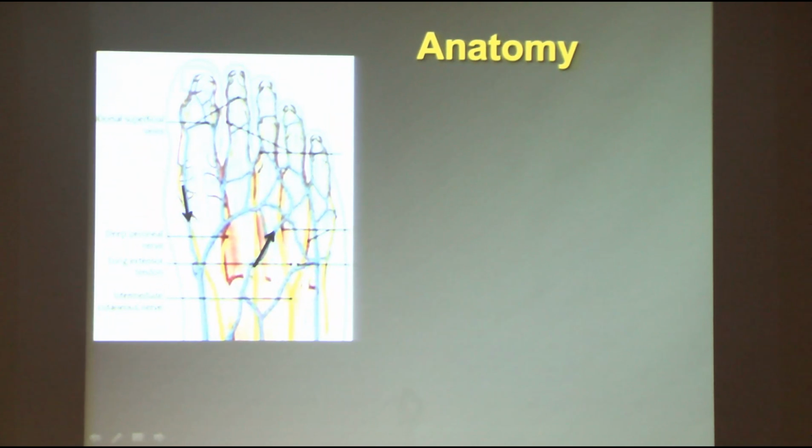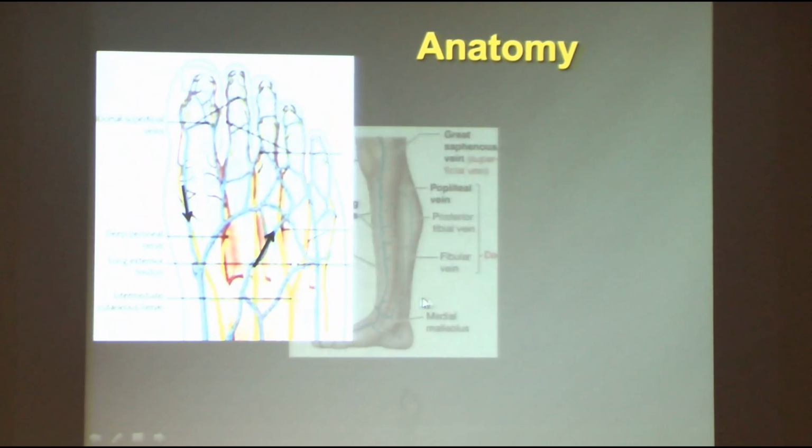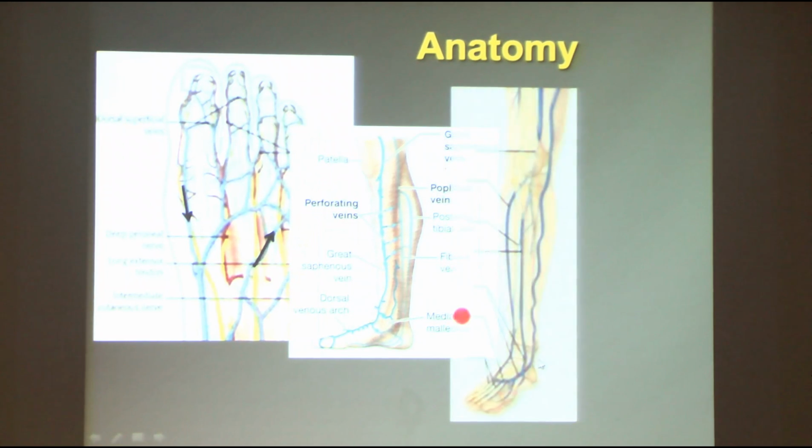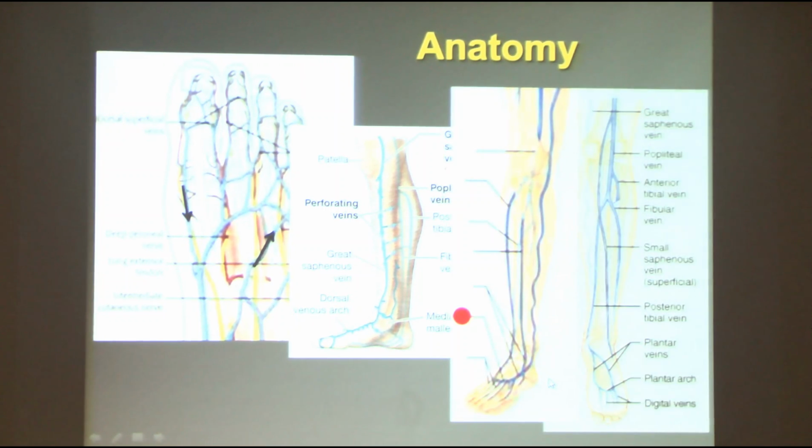So just an anatomy of the flow of contrast or blood in the foot and in the calf. And basically when we put the contrast in one of these veins, it goes up the saphenous vein and also deep into the plantar vein and then into the deep veins. So we usually fill the deep and superficial veins at one time.